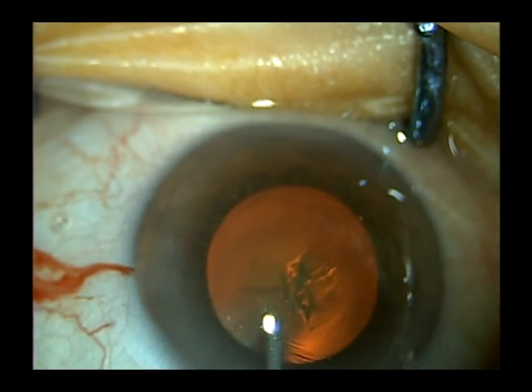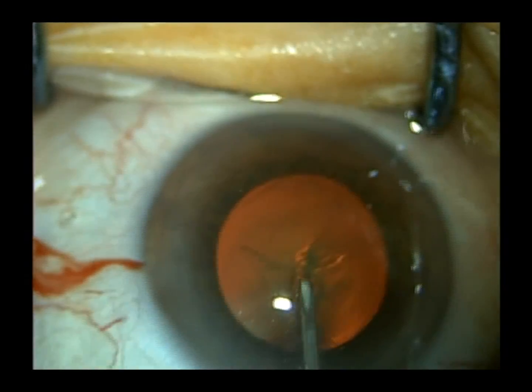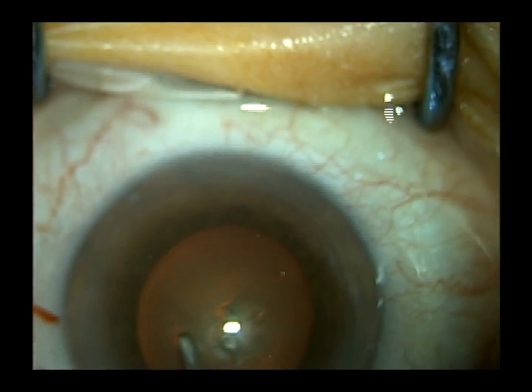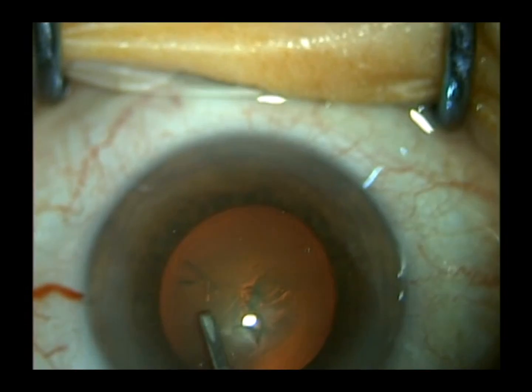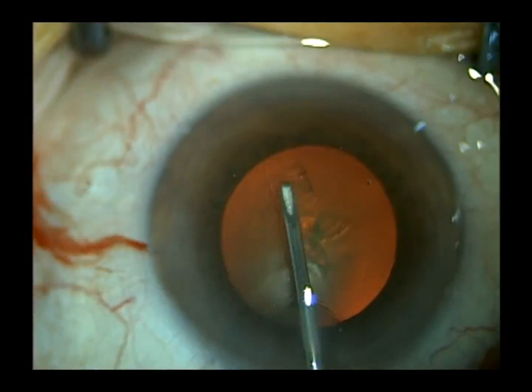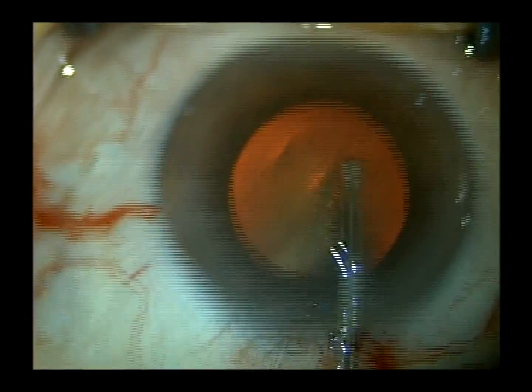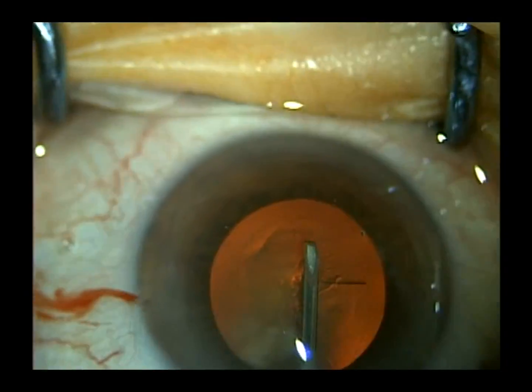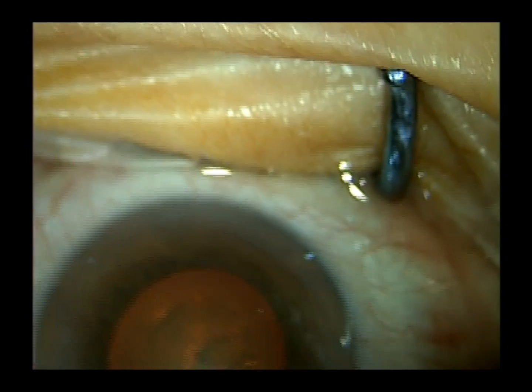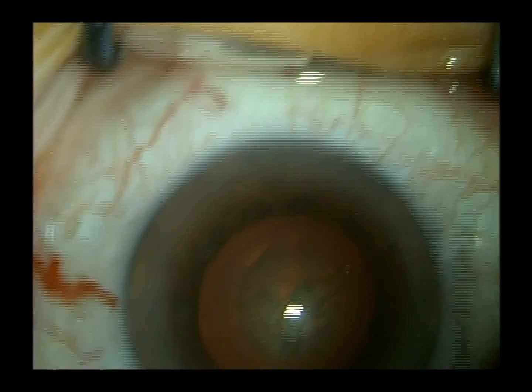I like the bent needle cystotome because I can just go into the eye one time rather than creating an opening and then putting in a pair of Utrata forceps, which would require me to puncture with one instrument and then usually tear with another. Also, if I get shallowing of the anterior chamber while creating my capsulorhexis, if I used Utrata forceps, I'd have to come out of the eye, put in more OcuCoat or more viscoelastic of choice, and then restart. This allows me to do everything with one tool.